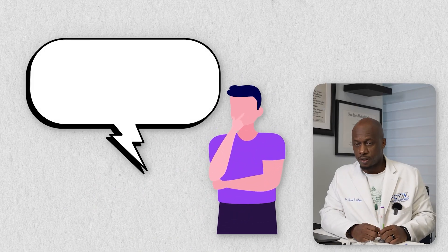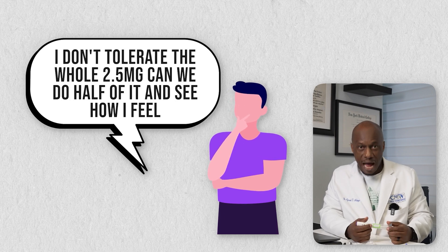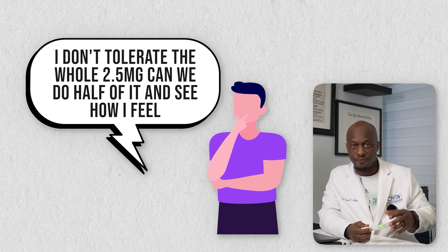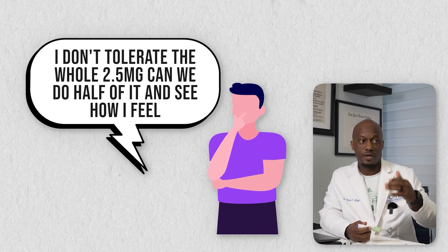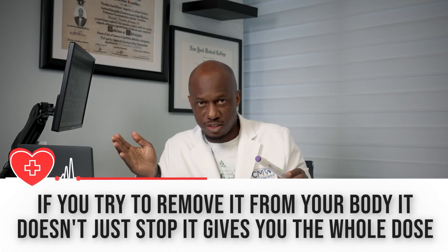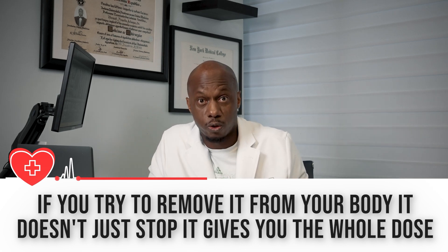Patients come in asking whether they can do half of 2.5 milligrams — maybe half this week and half next week. With this pen, there's really no way to do that. You can't save half a dose, because if you try to remove it mid-injection, it doesn't stop — it delivers the whole dose, the full 2.5 milligrams.